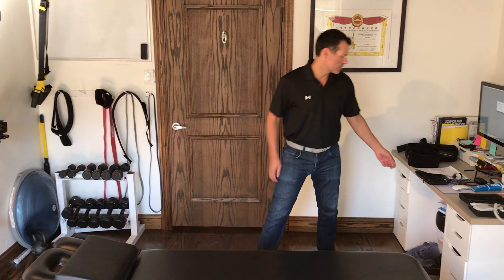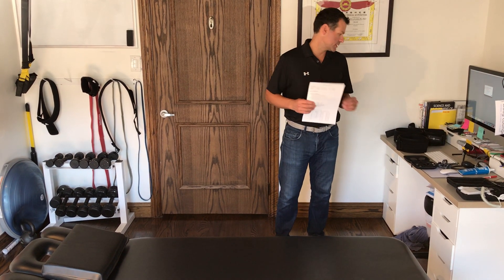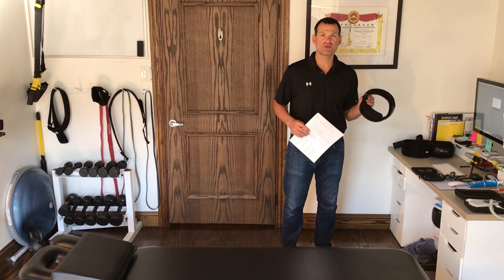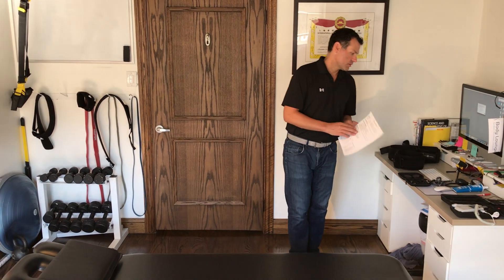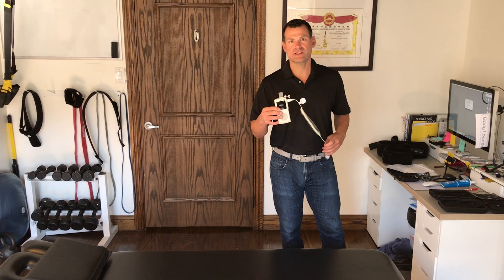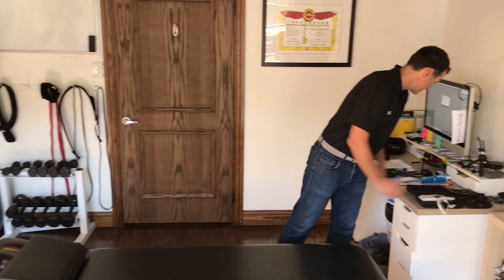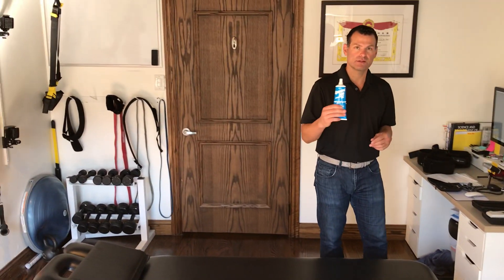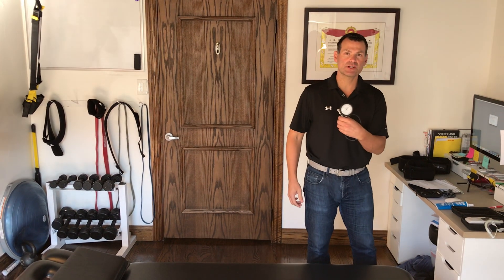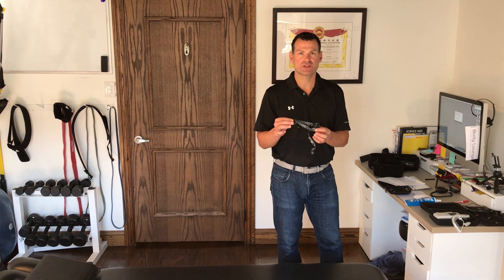What we're going to need: our BFR worksheet, cuffs that are appropriate for the size of the patient or client, the auditory Doppler ultrasound, a little bit of ultrasound gel, a sphygmometer, and a tape measure.